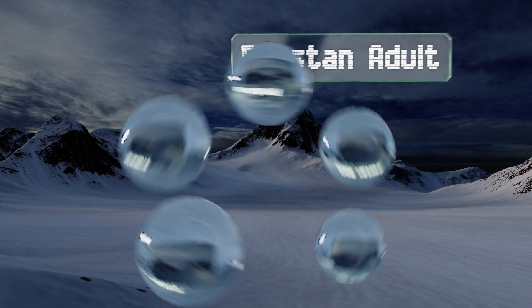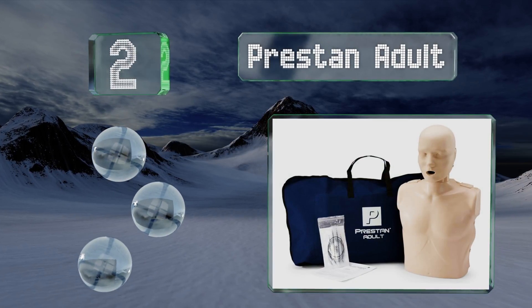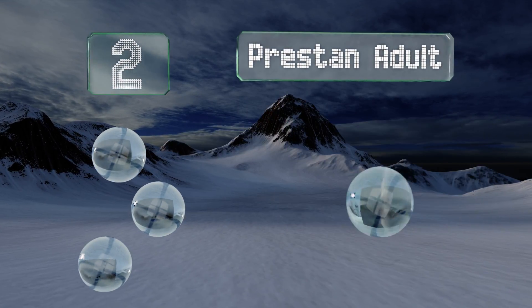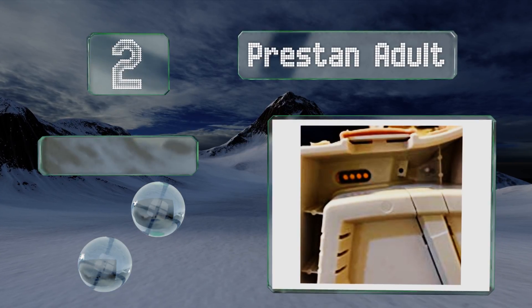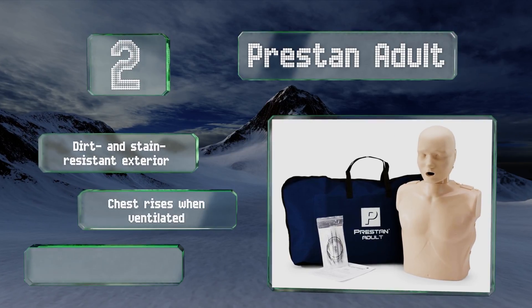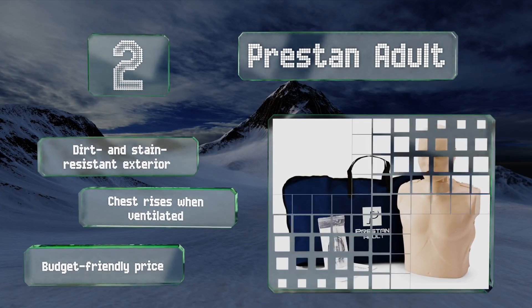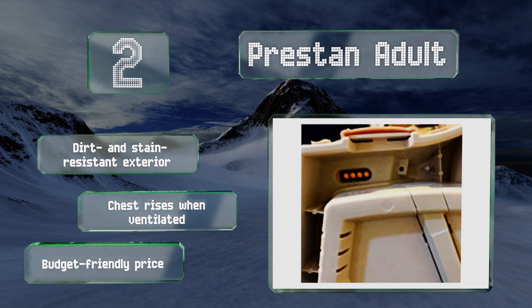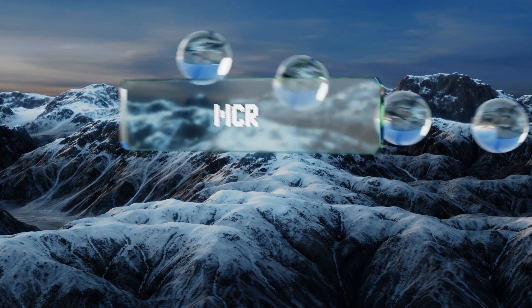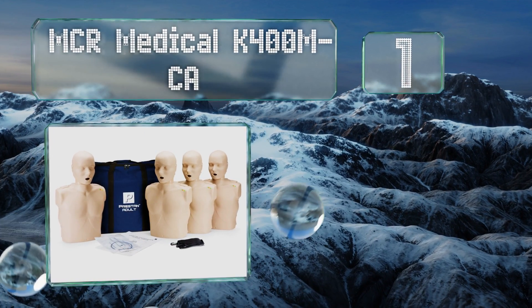At number two, the Prestan Adult is packed with useful features. A tiltable neck allows a teacher to illustrate the right way to open the airway, and an audible click lets students know they put enough pressure into their compressions. It's equipped with a dirt and stain resistant exterior and a chest that rises when ventilated. It also comes in at a budget-friendly price.